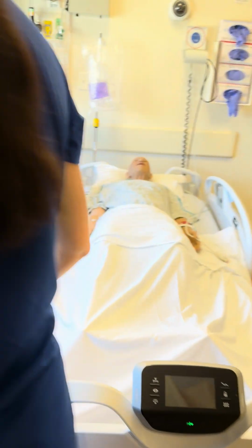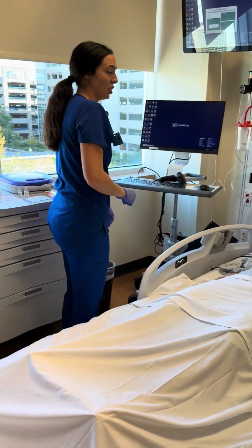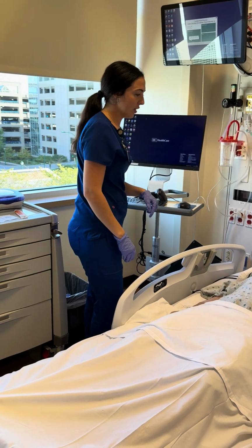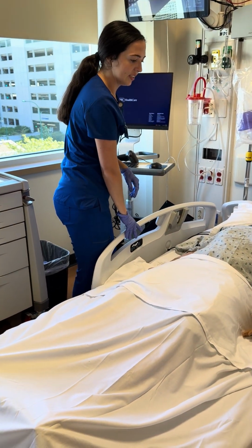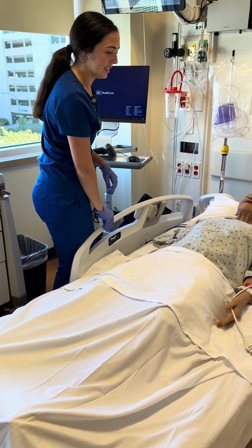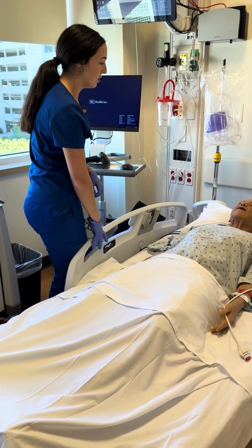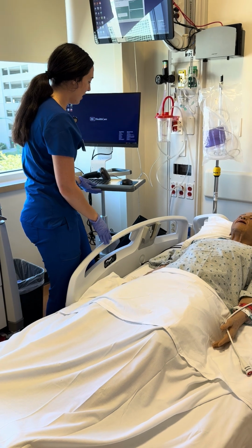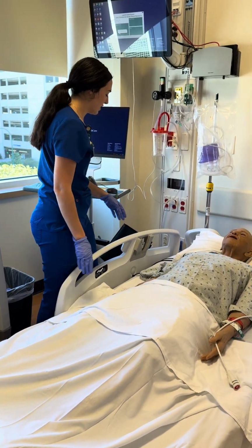Okay, I'm going to come over here. I've made sure that my trash can is in the place that I would like, and I'm going to pull up their chart. All right, can you verify your name and date of birth for me? Ivy Armstrong, 3/9/1964. Perfect. And any allergies? Just latex.